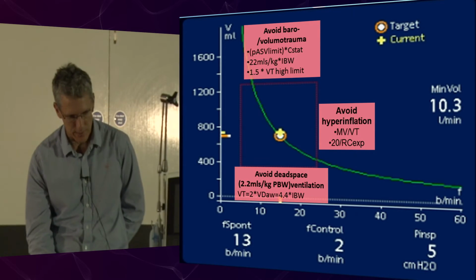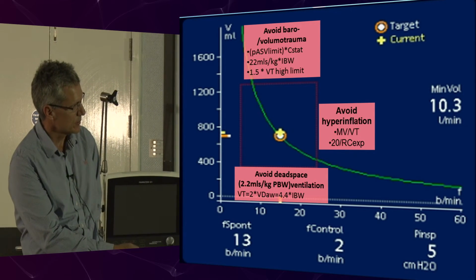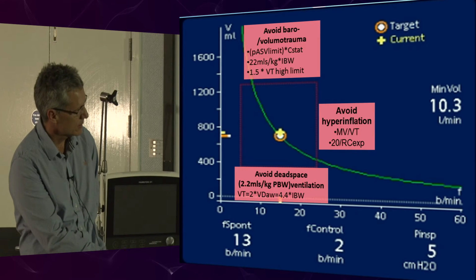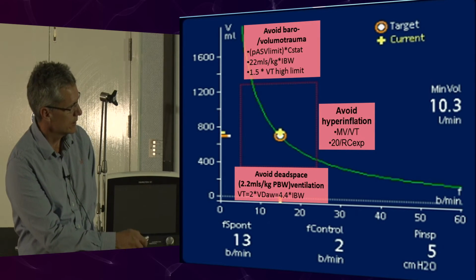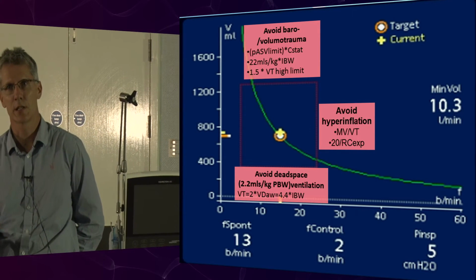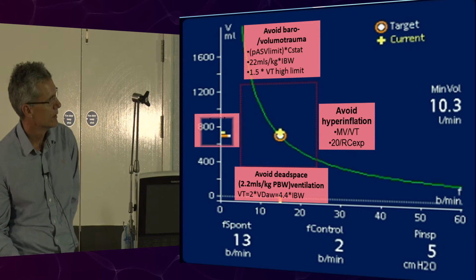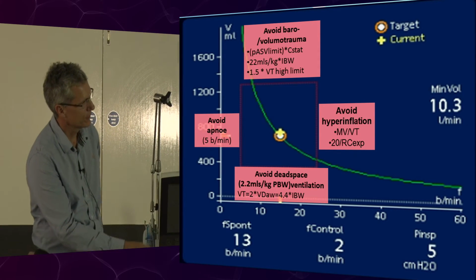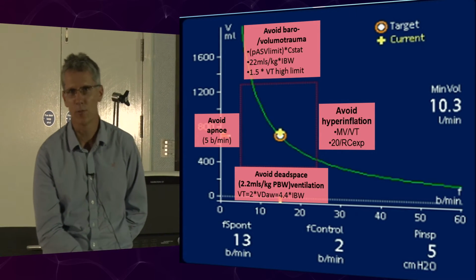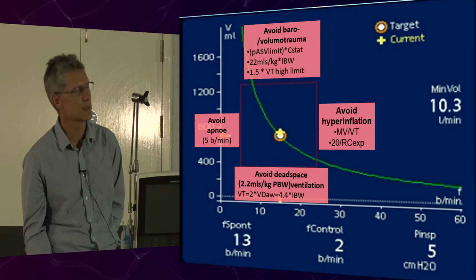If you imagine a patient with a high time constant, so COPD, so say the time constant is 2 seconds, you have 20 divided by 2, so it means the border will be over here, and this gives the patient a lower respiratory rate. If the patient has a low respiratory rate, you're less likely to get gas trapping. And then the last box here is 5. This is just to stop you getting a tidal volume of 7 litres and 1 breath a minute. This maybe should be 8, but 5 is what's been set.